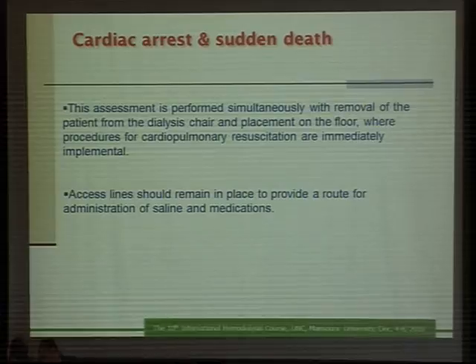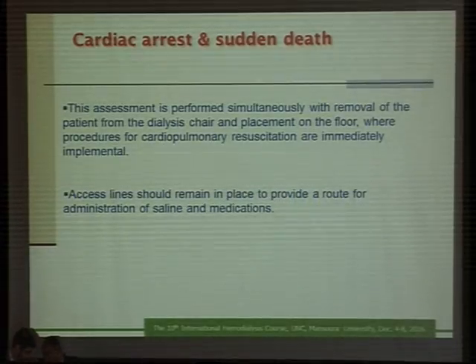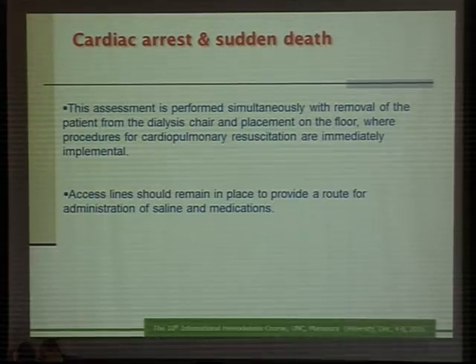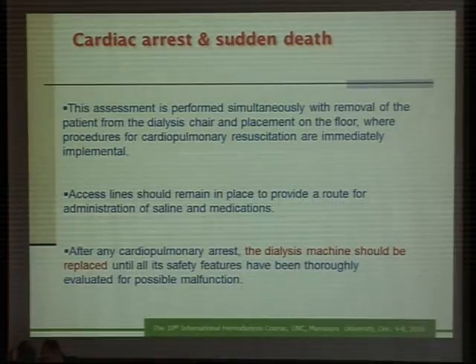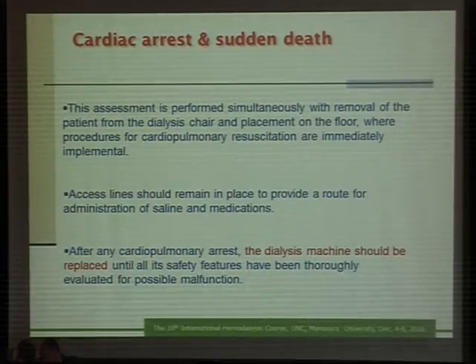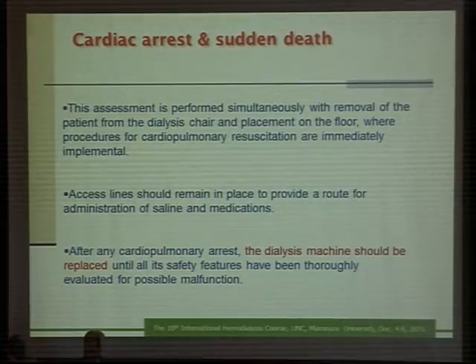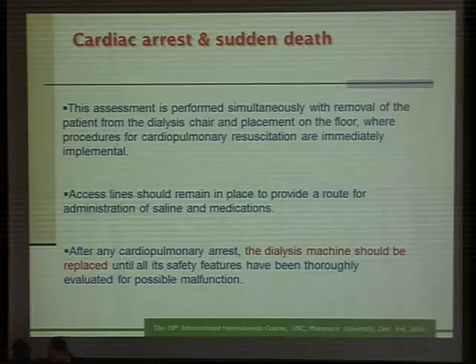The access line should remain in place. Actually, this is a very important point, to be used as a route for administration of fluids and medications. And after any cardiopulmonary arrest, the dialysis machine should be replaced until its safety features have been evaluated for possible malfunction.